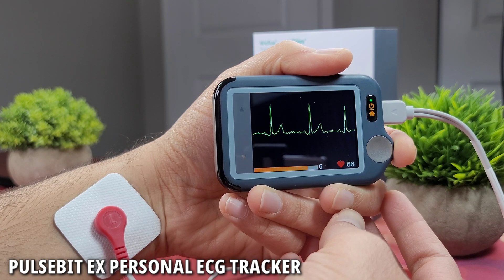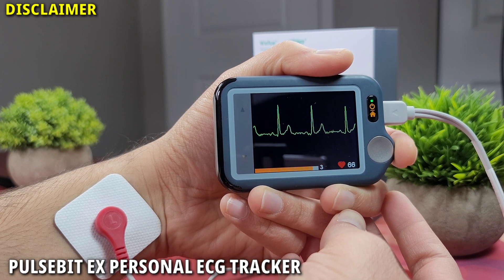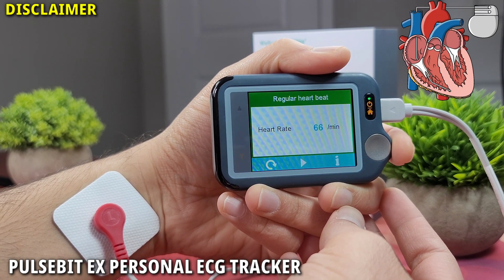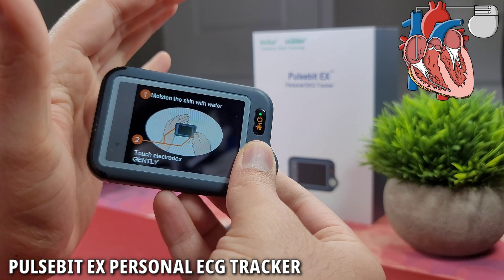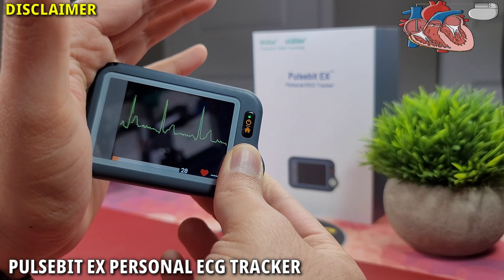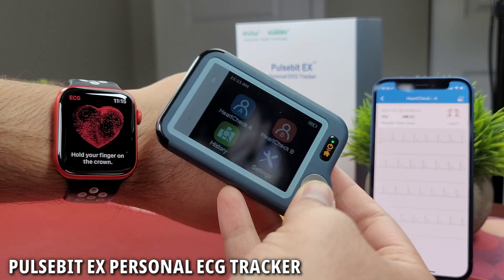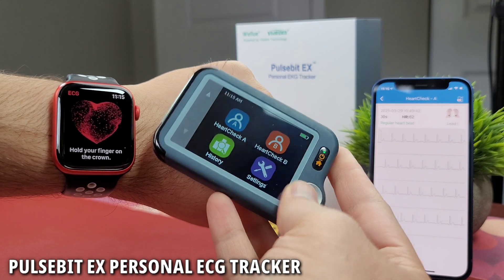Right off the bat, this device should not be used for any medical diagnosis or condition. If you have a pacemaker or an implantable cardioverter defibrillator, you should talk to your doctor before using such devices. This product is intended for general wellness use, just like your smartwatch.